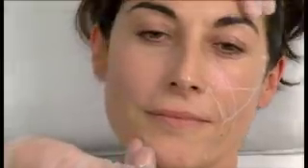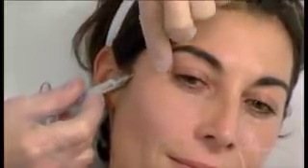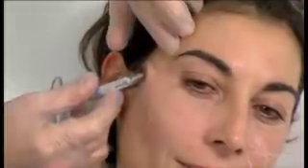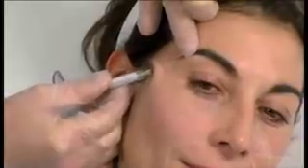So I'm going to go back and, if you don't mind, use the same injection site that I've used previously. It's probably blocked now because of the coagulation. And I will go back with my cannula, and just quickly, before we have to close this session, go towards the eyebrow. You can see that she has a nice skin laxity, and I can use that skin laxity to actually get to where I want my cannula to be. See, I always palpate and look at where my cannula is.